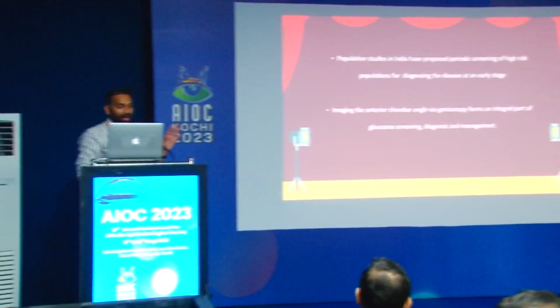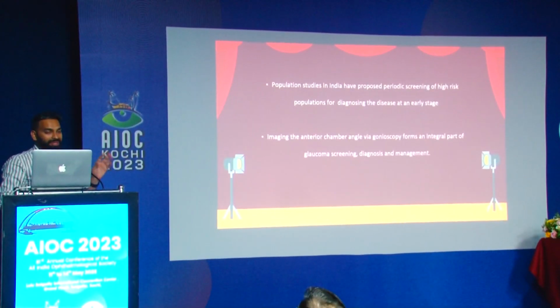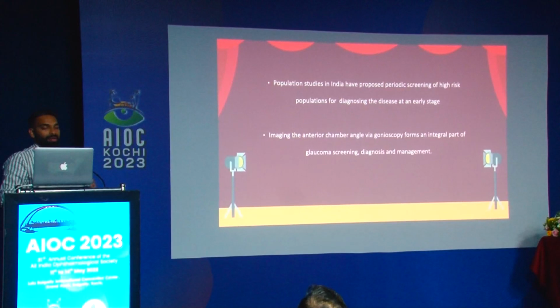As we all know, population studies in India have proposed periodic screening of the high risk population for diagnosis of the disease at an early stage, and imaging of the anterior chamber angle with gonioscopy forms an integral part of this glaucoma screening, diagnosis and management.